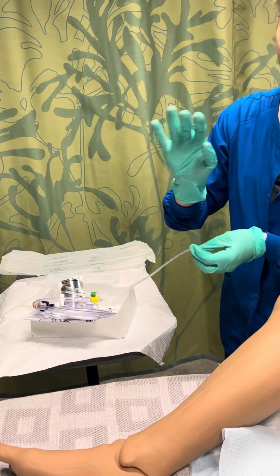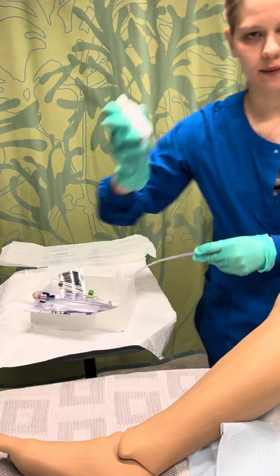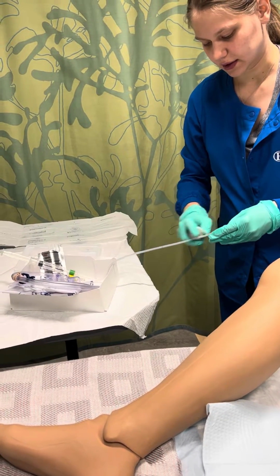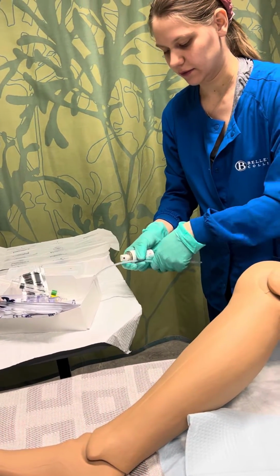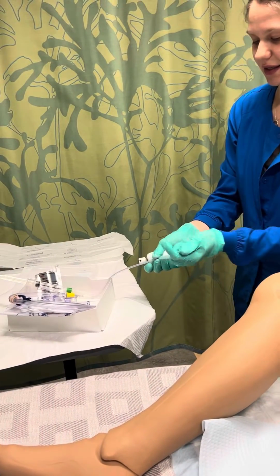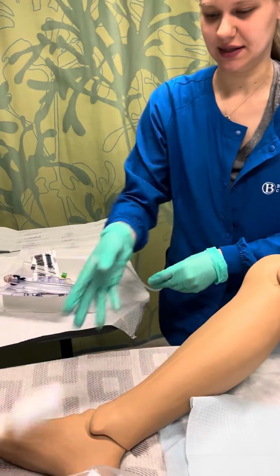And this is not part of my sterile procedure, but this is just for our lab for the mannequin. I'm going to lube up my Foley to insert because the mannequin gets a little sticky. So pretend this isn't happening.